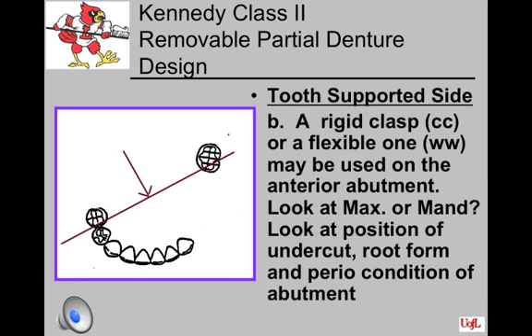The secondary abutment on the tooth-supported side can be either a wrought wire clasp, a cast round, a cast circumferential, or sometimes an I-bar. Think about your fulcrum line and the force on the tooth as the edentulous extension base area is depressed under occlusion. As that depresses, the partial rotates about the fulcrum line and the tooth gets torqued to the lingual. The most kind treatment of the tooth is the wrought wire clasp, as it flexes more than a cast circumferential. We do need a 0.02 mesiofacial undercut in the cervical third, but not on the gingival margin.